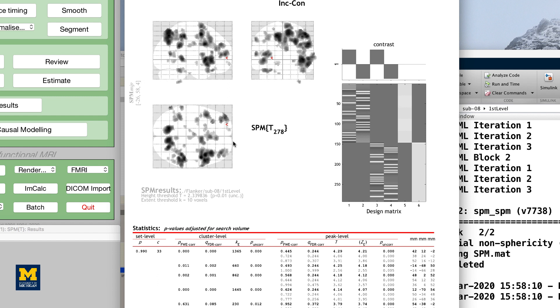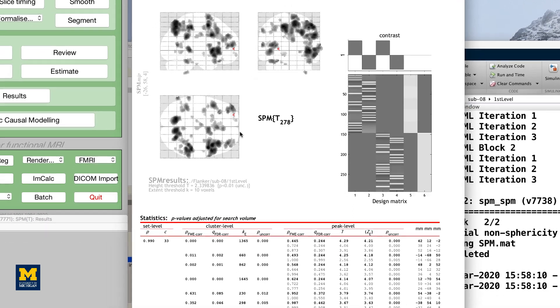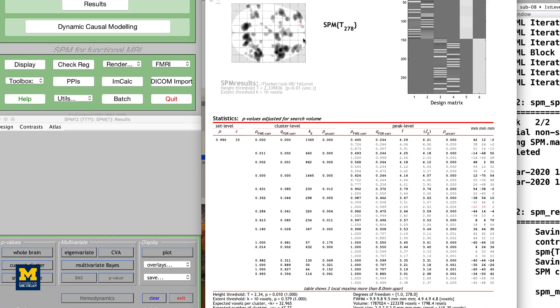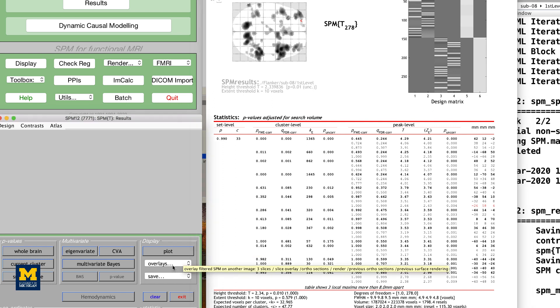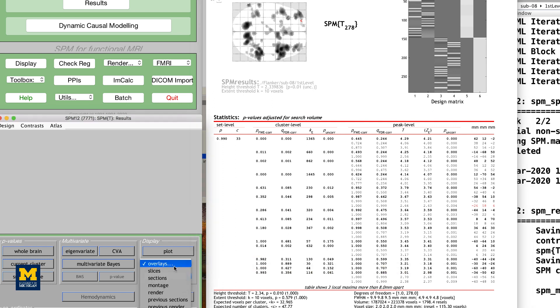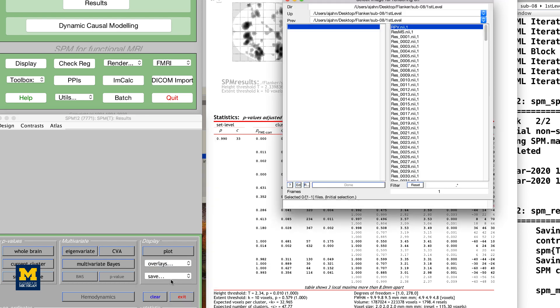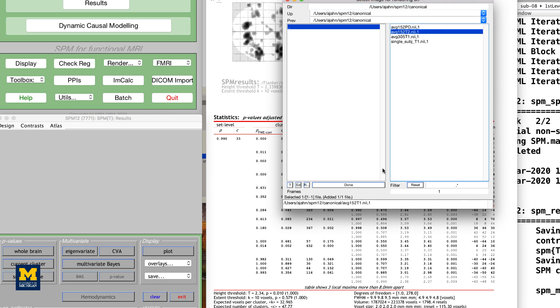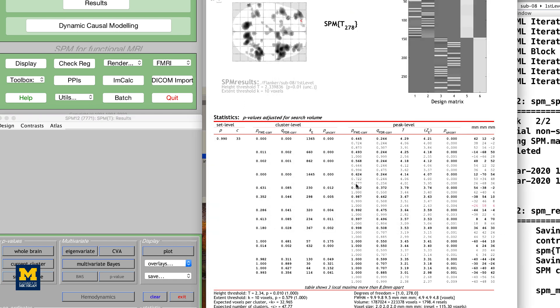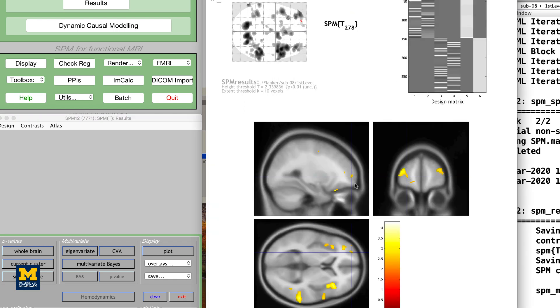To view the results on an image other than the glass brain, in the results window in the lower left, which contains the fields p-values, multivariate, and display, click on overlays, and then select sections. Navigate to the SPM12 canonical directory and choose any of the T1 brains that you like. In this case, I will select the average 152 brain. You will now see the results displayed as a heat map on the template brain you selected, and you can click and drag the crosshairs as you do in the display window.